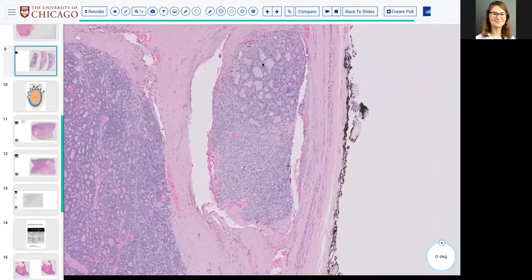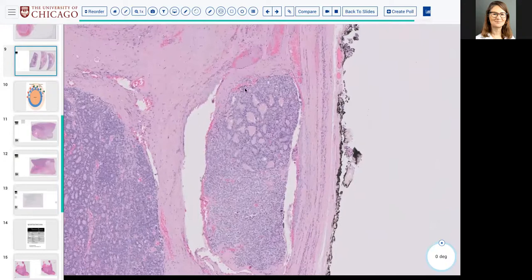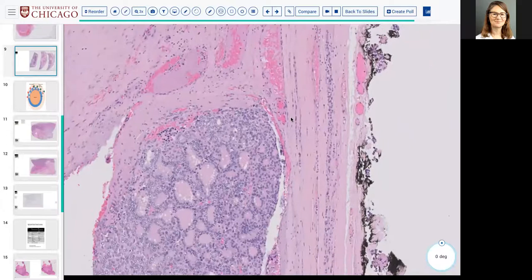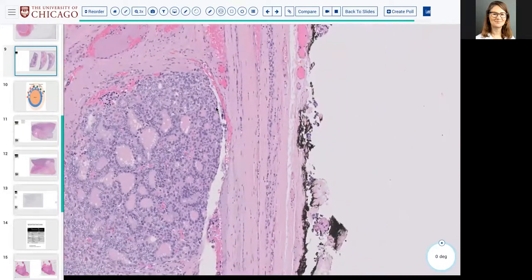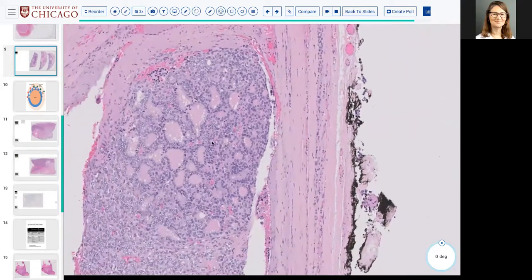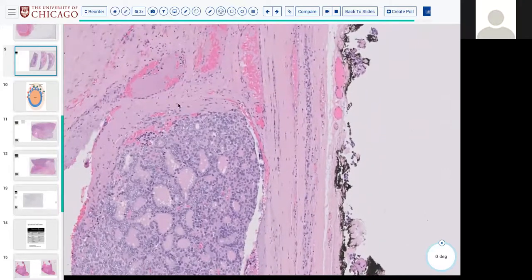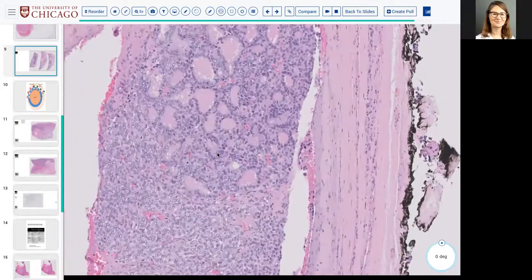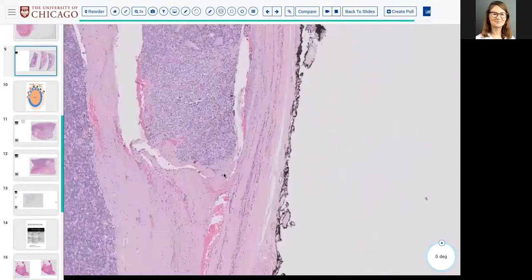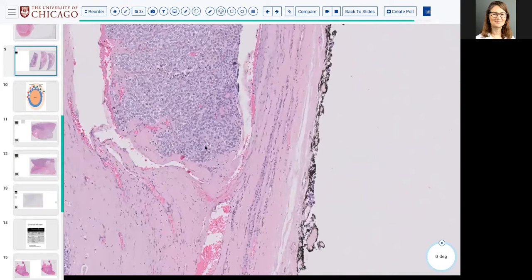So how do you determine biologically significant vascular invasion? And this is it. But what are the features that you're seeing? It's like within the lumen, you kind of see the red blood cells and probably some fibrin attached to this chunk of tumor. Yep. So this is a thrombus, yeah. Exactly. There's thrombus and there's endothelial lining and there's adherence to the vascular wall.